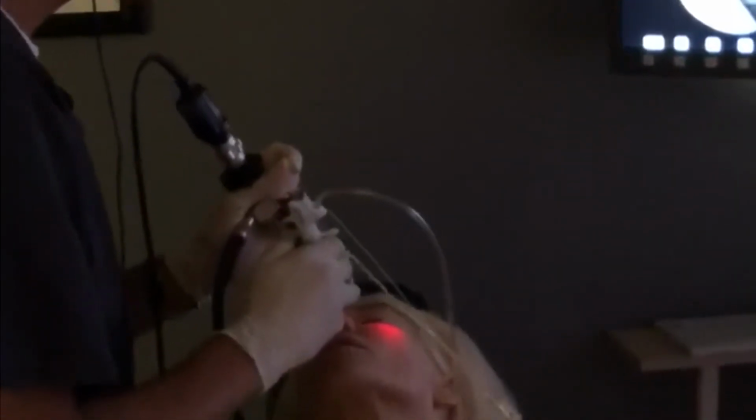We're inside the sinus, and you can see that the left maxillary sinus is illuminated and the balloon is inside the sinus. So right now the guide wire is inside the left maxillary sinus, and you can see the sinus illuminated, and now we're passing the balloon over the guide wire to dilate the sinus.